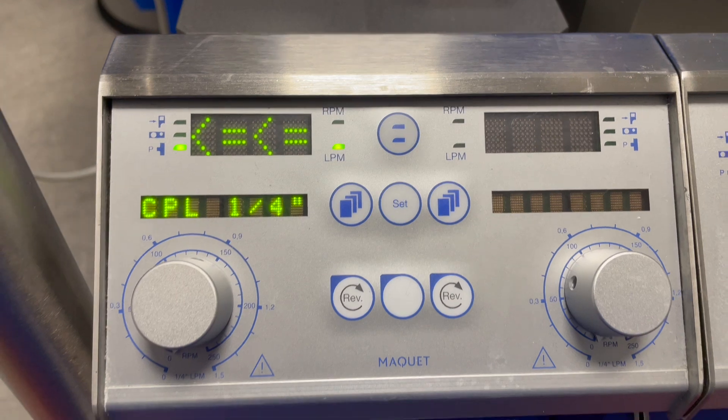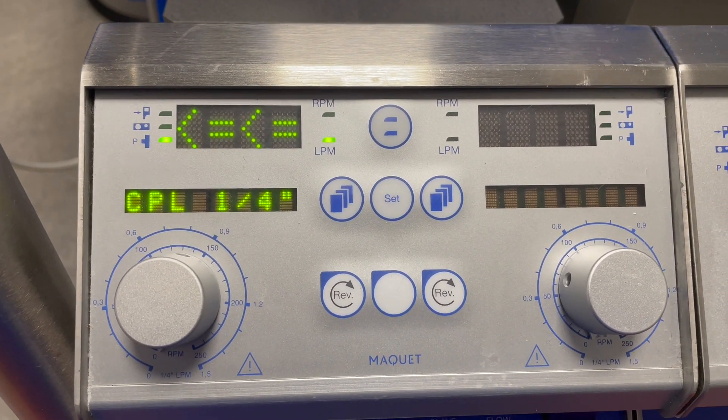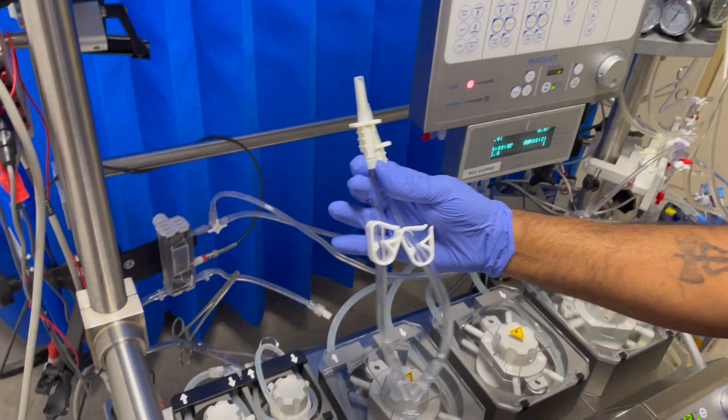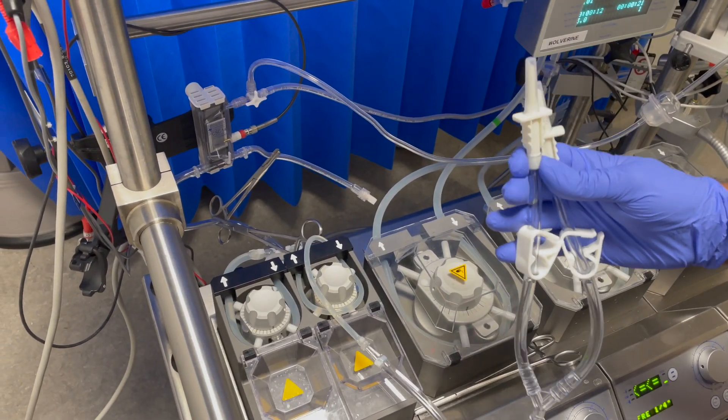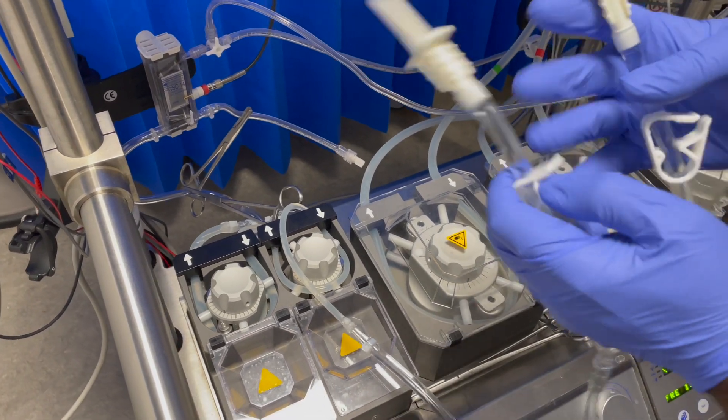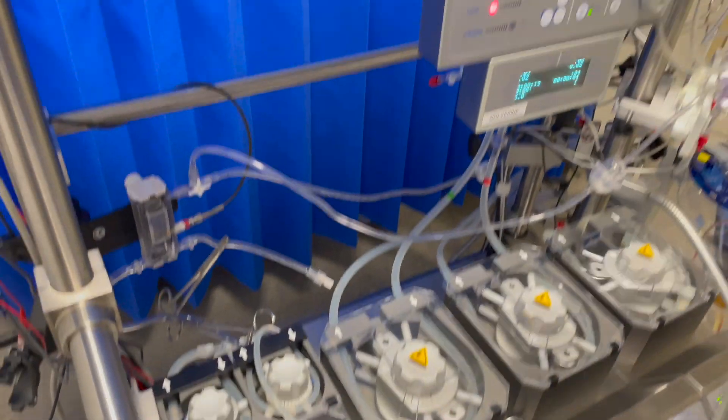Place the blood pump head inside the roller. Leave the cardioplegia pump head outside the roller. Start running the blood pump to fill the cardioplegia delivery system. Since the plegia tube is outside the roller, you can prime the plegia line backwards with the blood pump pressure.